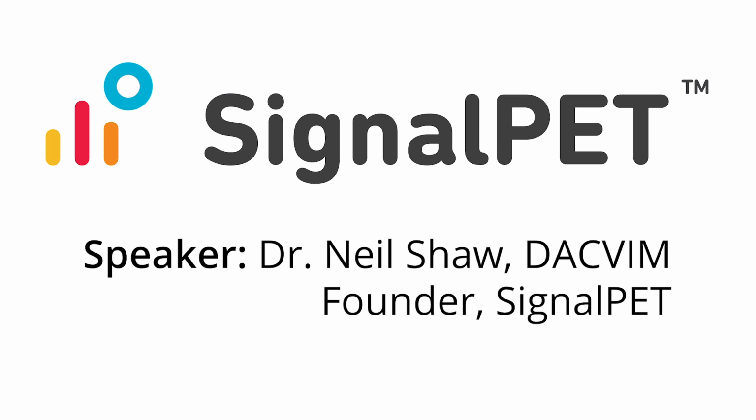This is the first in what we anticipate will be a series of webinars about radiology, and specifically revisiting radiology utilizing SignalPET. SignalPET, as most who are watching are aware, is actually the first AI-driven instrument in veterinary medicine to assist veterinarians and veterinary radiologists on radiographic interpretation, and it has made tremendous progress.